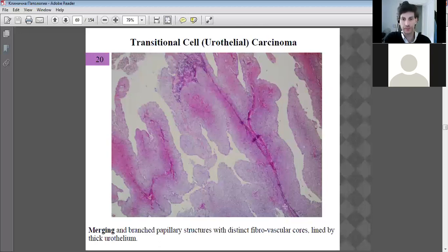And your lecture talks about fibrovascular cores. There's a lot of hardening in the tumor itself. It becomes a hard structure, and the fiber adds in the central bit here. There's fibrovascular areas here. There's some fiber there developing. A lot of fiber here, so the darker purpley bits are the fiber.